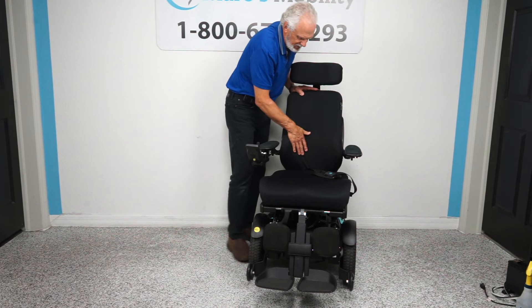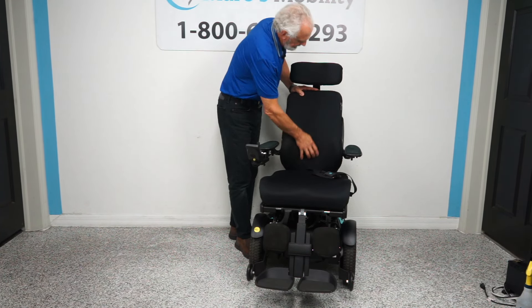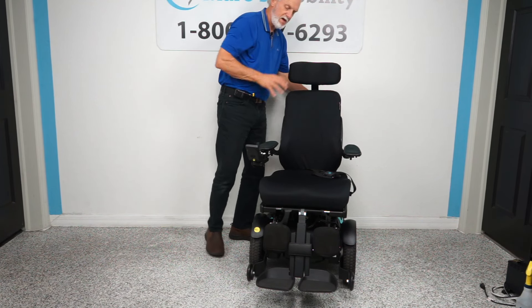This is a contoured back — it's about three or four inches deeper than the sides, so it keeps you centered. The headrest is a big, fully adjustable headrest — probably 12 to 14 inches wide, so it's bigger than normal.